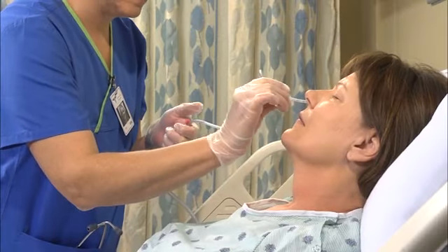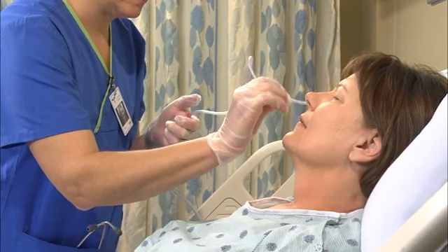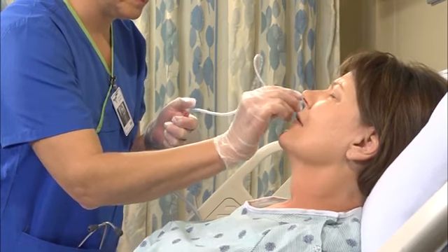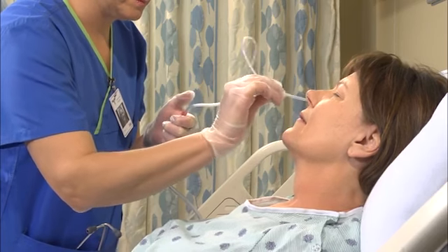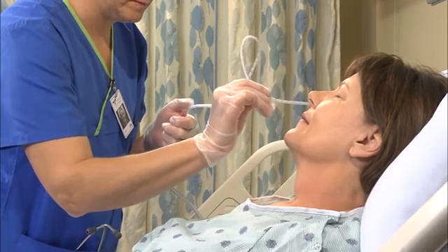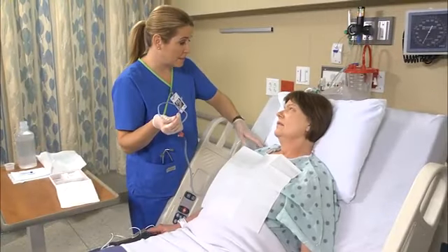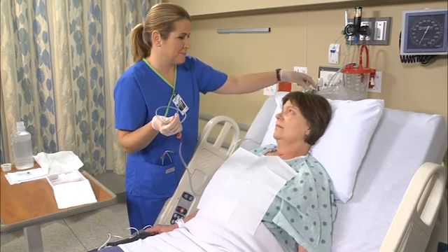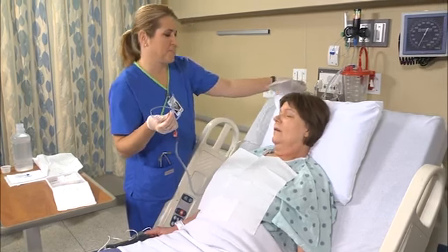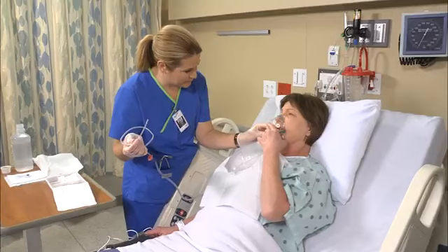Apply intermittent or continuous suction by placing your non-dominant thumb over the vent of the catheter for 15 seconds or less. At the same time, slowly withdraw the catheter as you roll it back and forth between your dominant thumb and forefinger. Go ahead and cough for me. Then encourage the patient to cough. Replace her oxygen device and instruct her to inhale deeply.